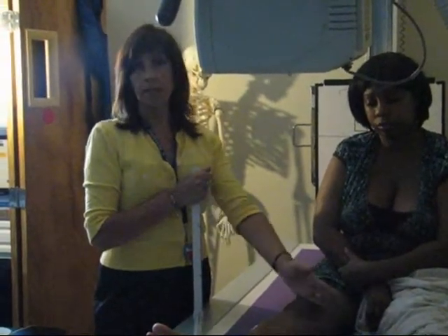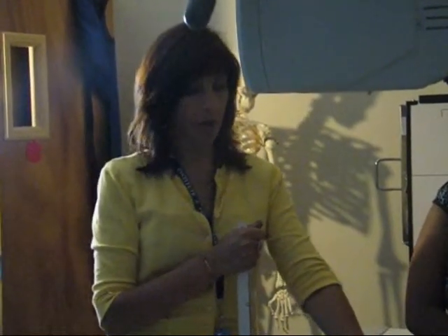There are also some supplemental views of the knee, of the joint spaces, that you can look at in your book and study through there. Our next view that we're going to actually demonstrate is the most common supplemental view, which is the sunrise view. And there are two ways to do the sunrise view, which we're going to demonstrate next.